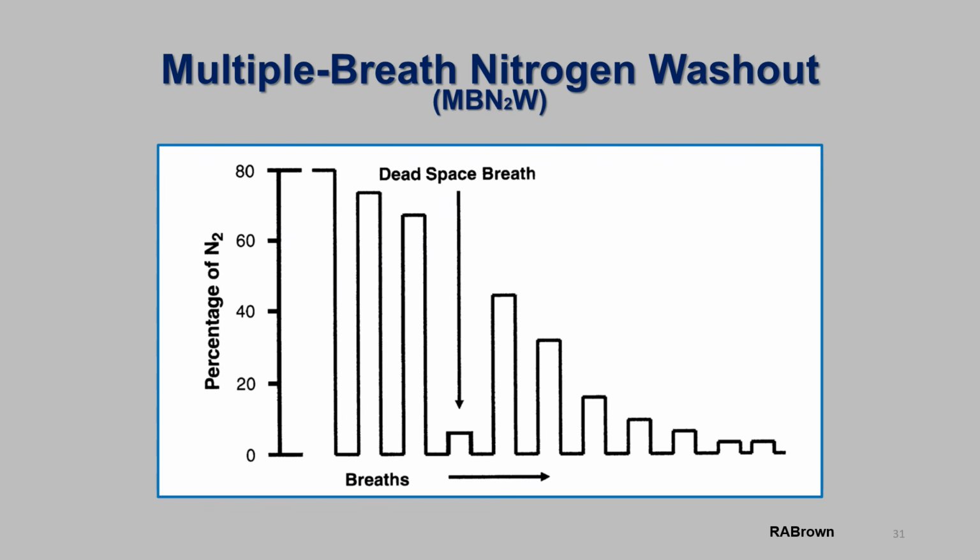This is a depiction of a dead space or a small breath during the multiple breath nitrogen washout FRC test. This breath is acceptable and does not compromise the quality of the testing process. A dead space breath may naturally occur or after the subject performs an inspiratory capacity or vital capacity maneuver.